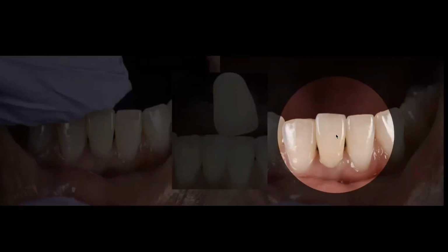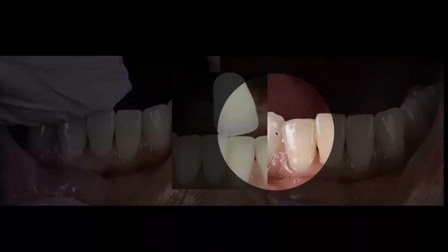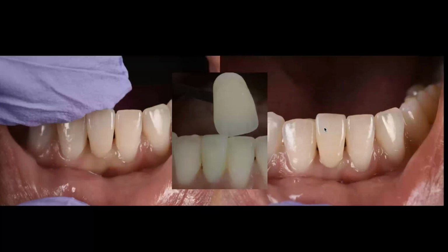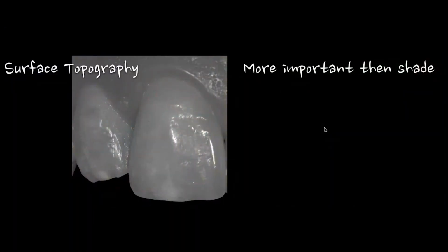See the distal line angle on the adjacent tooth, or the distal angle on mine could have been a little longer. Look at the mesial reflection on the adjacent tooth. Look at the mesial reflection on mine, could have been a little shorter, right? So I'm looking at these things, trying to figure out how do I make that improvement? How do I get those little details to really help them blend in with what we're doing? And a lot of times with these cases, it's much more about the surface than we give it credit for.